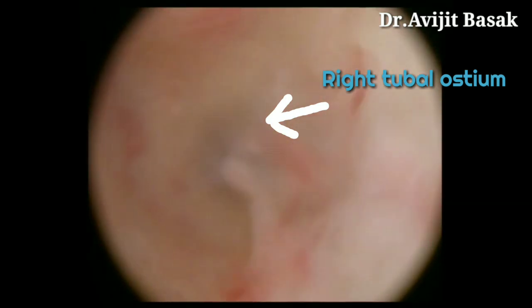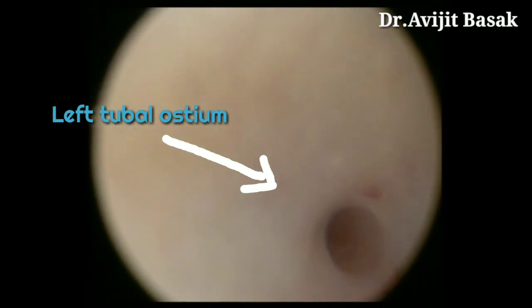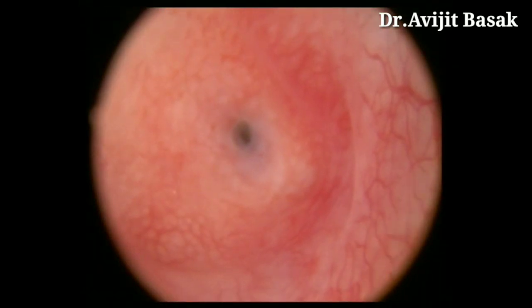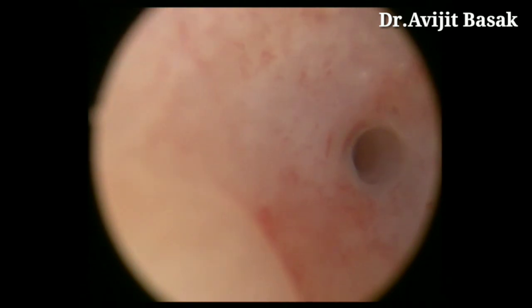This is the right tubal ostium. This is the left tubal ostium. This is the normal endometrial cavity, and we withdraw the hysteroscope from the uterine cavity through the cervix.